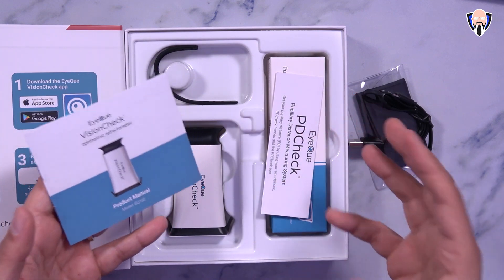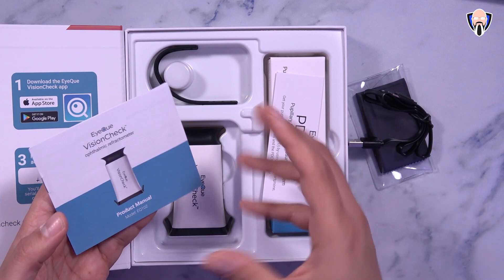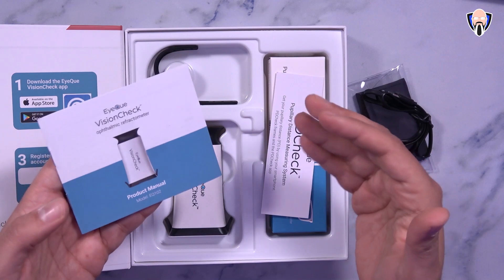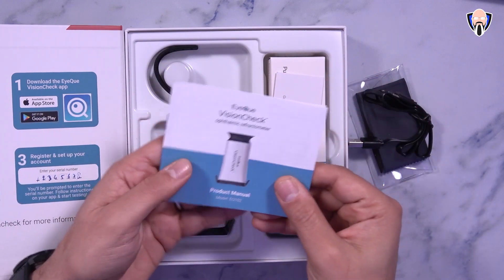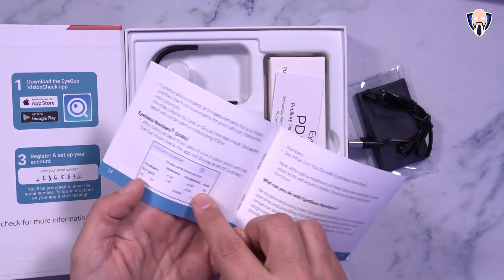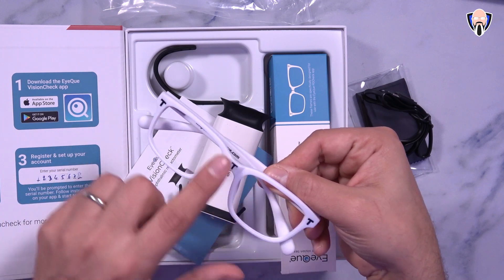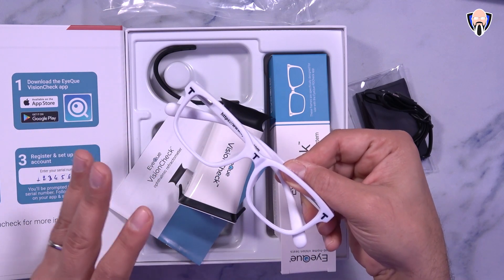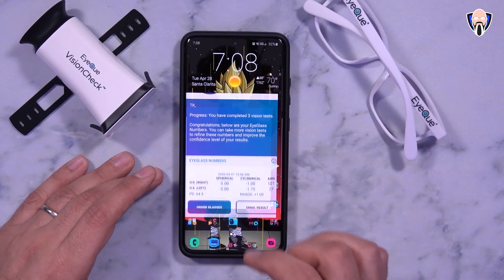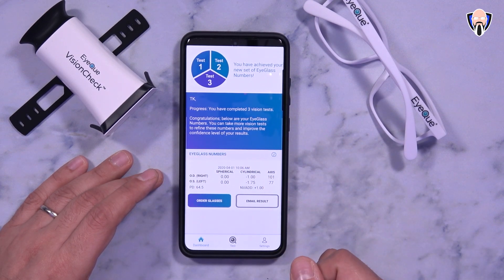Keep in mind that there is somewhat of a learning curve to this. There is a practice mode in the actual application that you should probably do at least three to four times before conducting the actual test, just so you're comfortable and understand how to do it correctly. There is also a product manual explaining exactly how to read the information. The glasses themselves have letter T's in them that we will need to align in the app once we're done doing our vision check. There's an application available on both Android and iOS called Vision Check — you can look it up directly in the Google Play Store and it'll come right up.